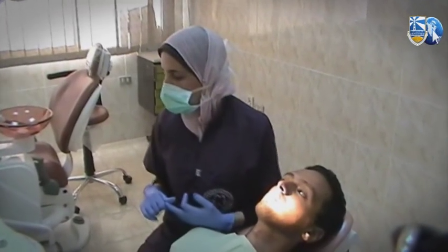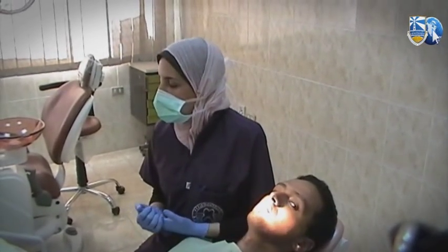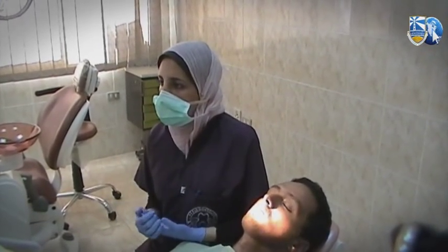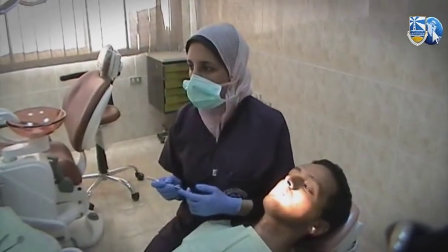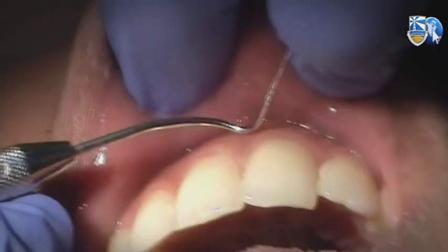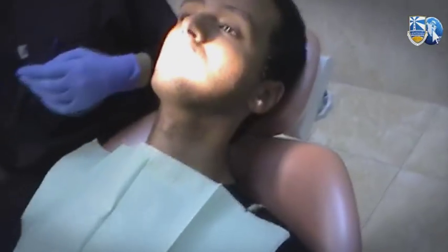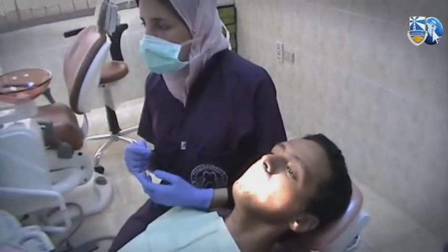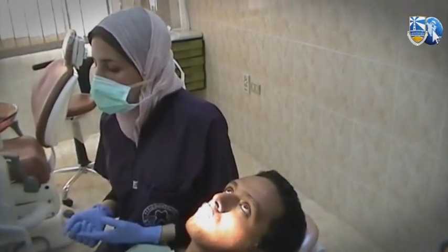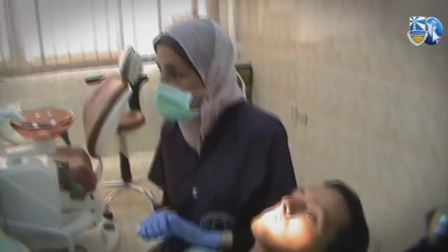Next is exudate. For example, exudate present in the oral cavity related to the teeth may be pus, which is related to an abscess. To test for exudate coming from the gingival crevice, I use the back of the periodontal probe or my finger to apply gentle pressure on the attached gingiva upward toward the margin of the gingiva. Any pus that can be drained through the gingival sulcus will come out. This is significant because diseases like diabetes mellitus are characterized by multiple periodontal abscesses, and by this method I can examine the presence of a periodontal abscess draining through the gingival sulcus.